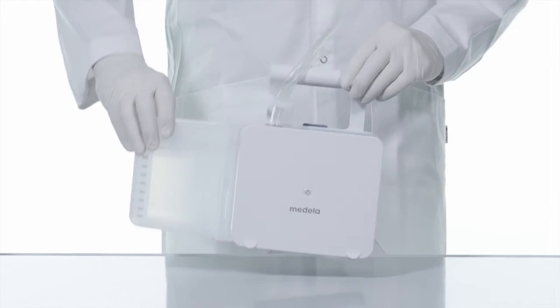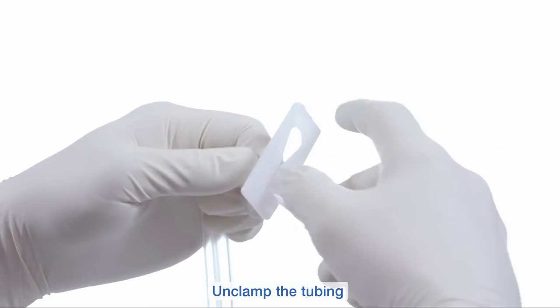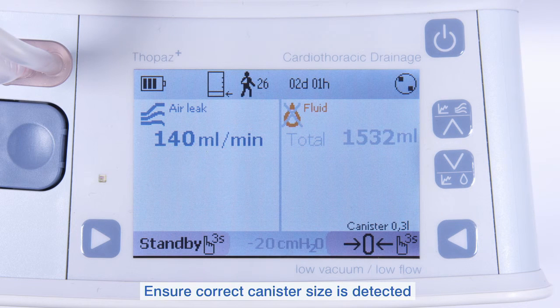Place Topaz Plus upright on a flat surface and press the on button. You can now unclamp the tubing. Ensure that the correct canister size is detected.